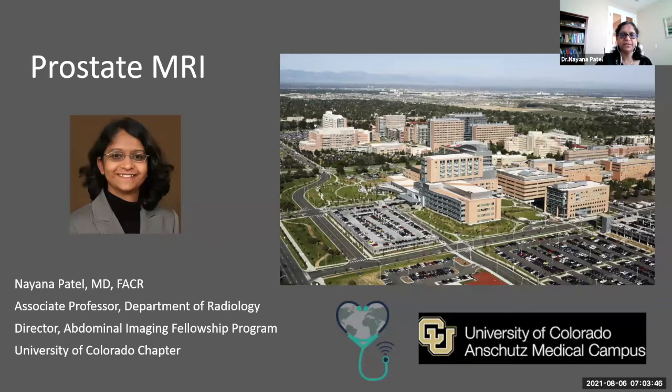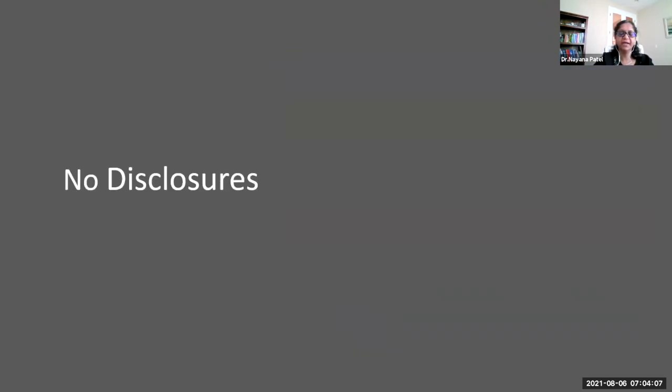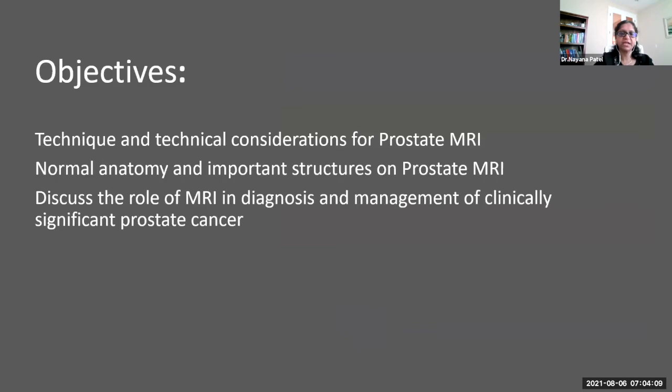So my talk for today is prostate MRI. As you know, this is a pretty broad and huge topic. There is no way I can cover everything about prostate MRI in a 1 hour time period. So what I have decided in this talk is to give you the overview of the prostate MRI. I don't have any disclosures.